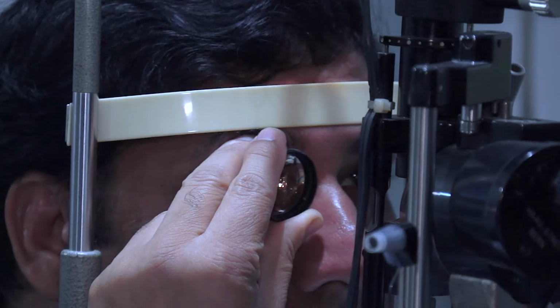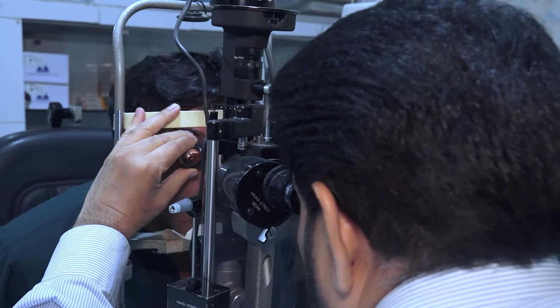This is a 78 diopter. This is called fundus biomicroscopy.